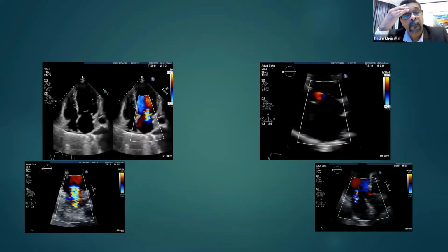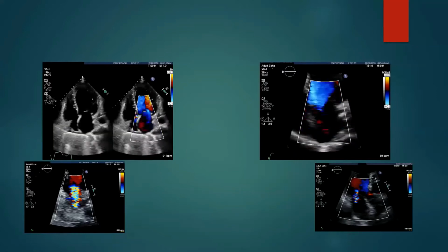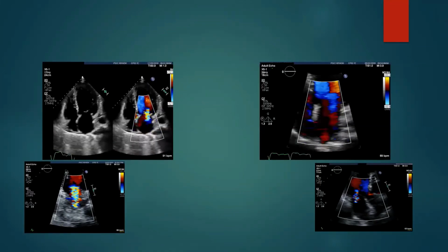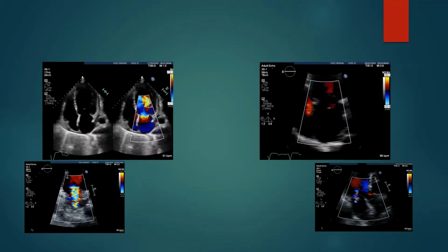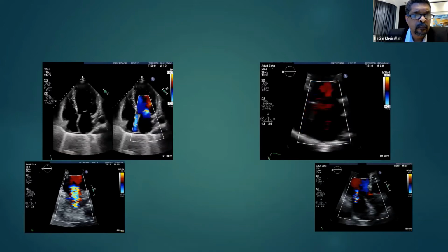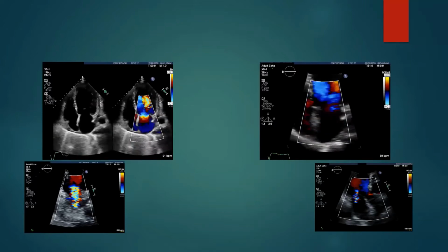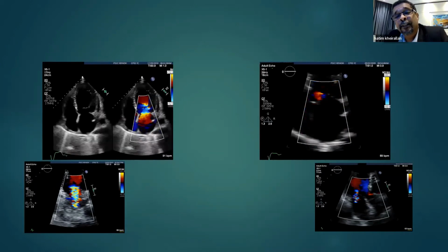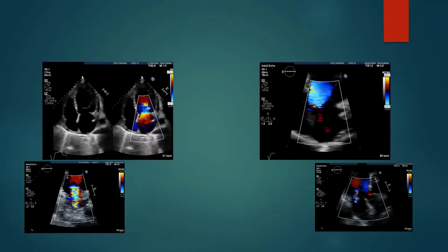Okay. I see a dilated left atrium. Yes. There is mitral regurgitation. Good. Eccentric mitral regurgitation. Could you tell how much? A bit tough, right? Severe mitral regurgitation, based on eyeballing of the jet. Yes.